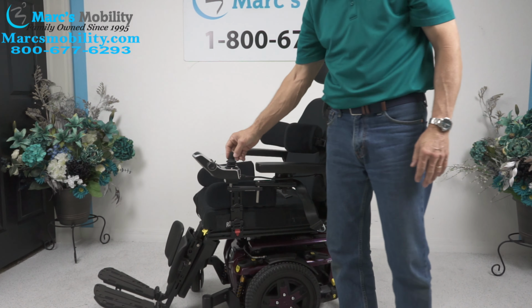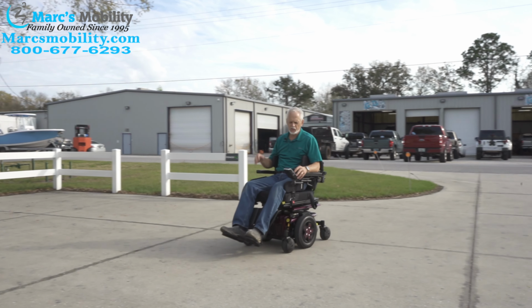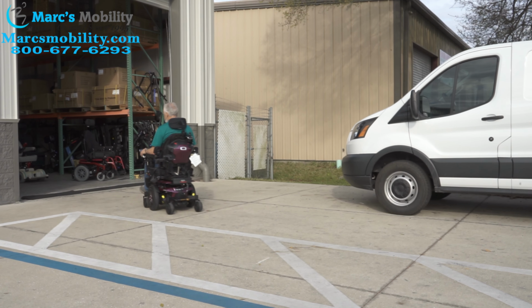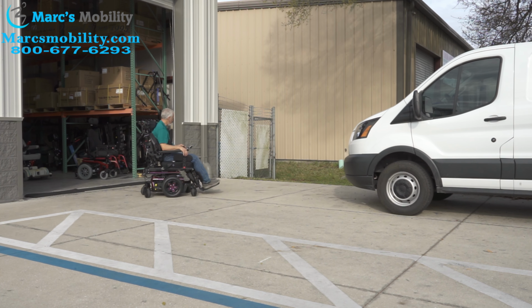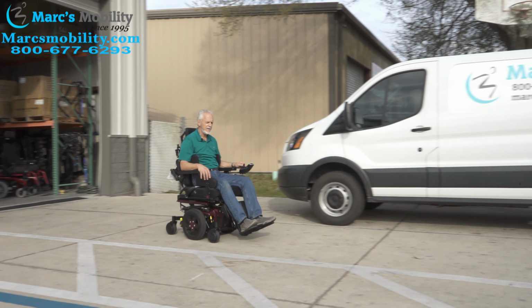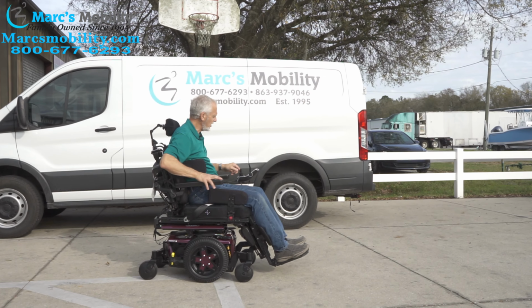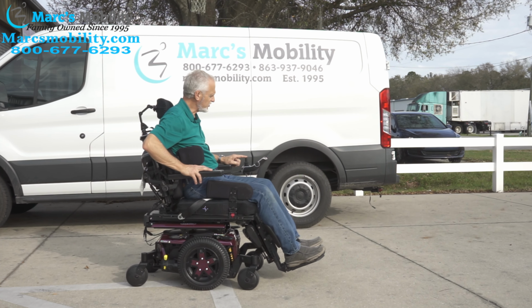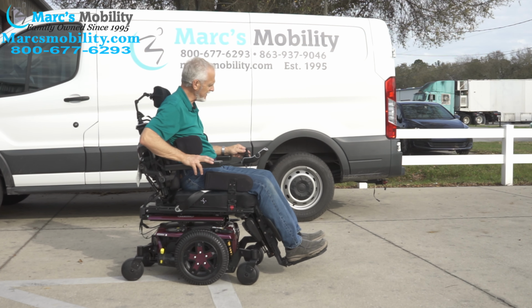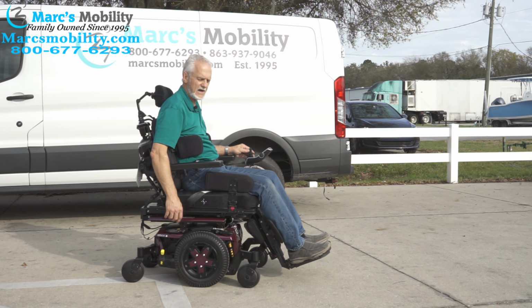All right, so this is the Quantum Edge 3. Top speed that I got going straight was 6.2 miles an hour. 6.2 is what the odometer read here. Very smooth, very easy to drive, and when you let go, it brakes automatically, and you can control the speed by not pushing the joystick all the way. So now I have it on fast speed, but if I just move the joystick a little bit, I can crawl with the chair. See that?